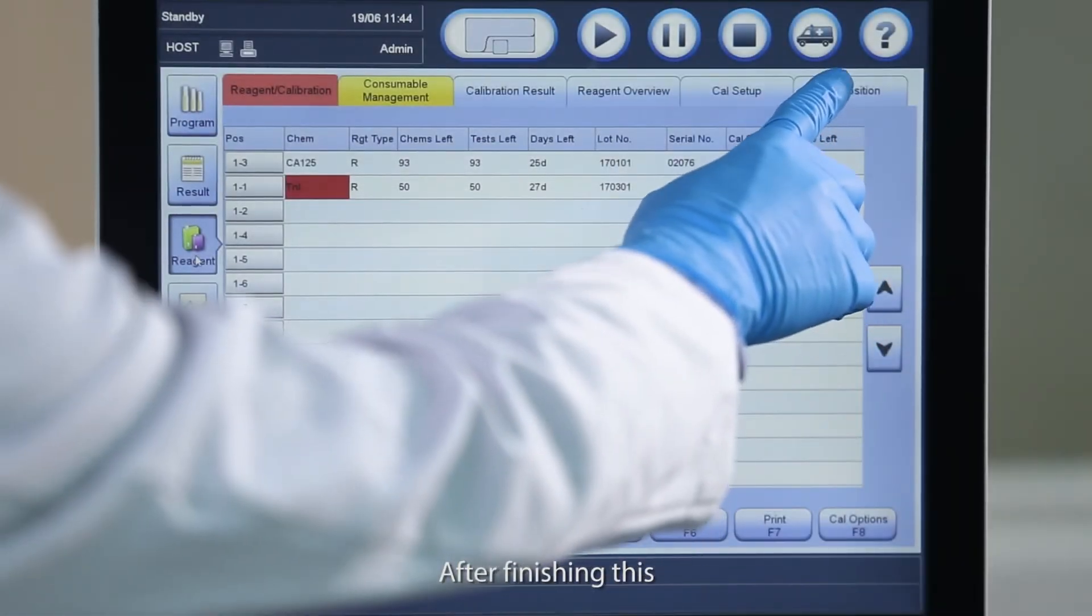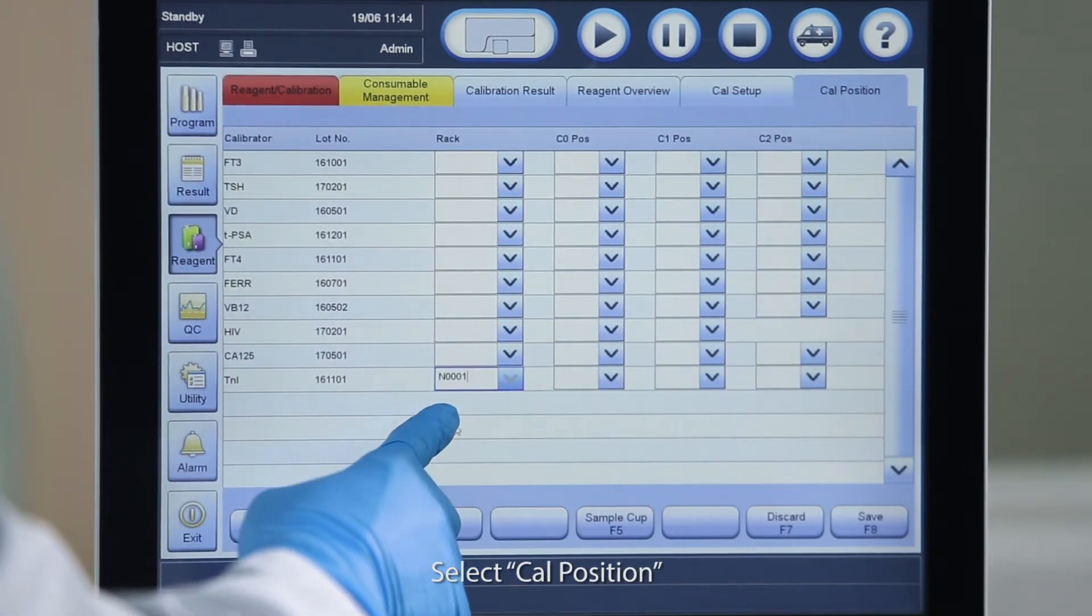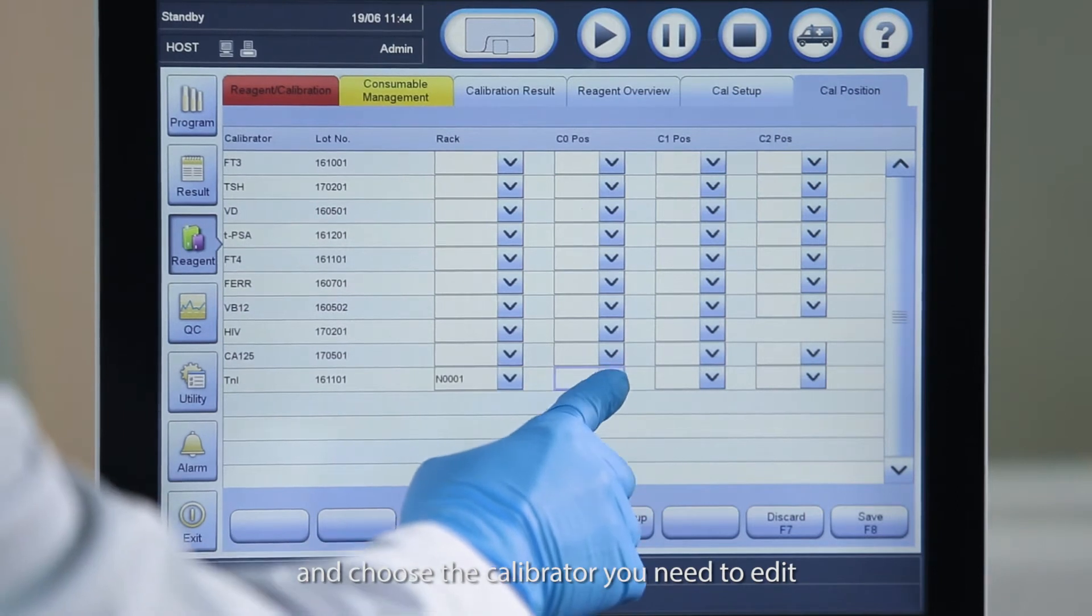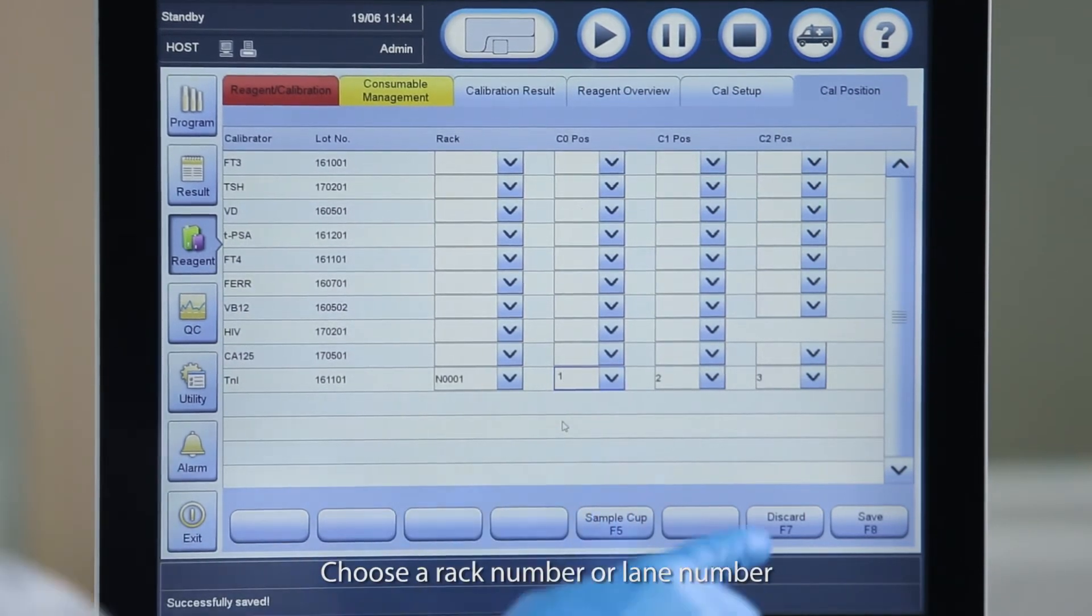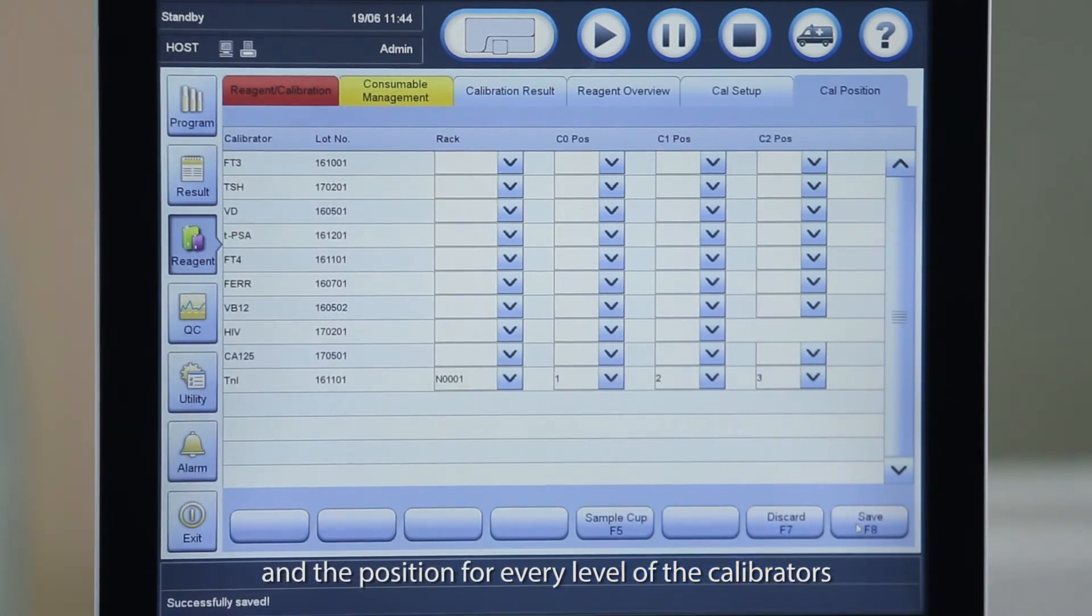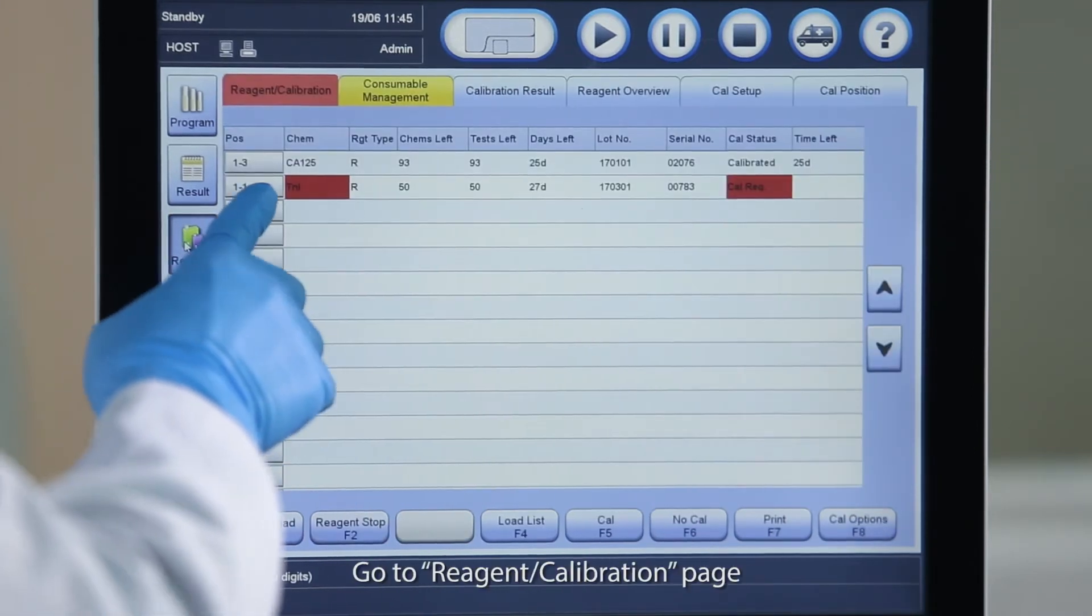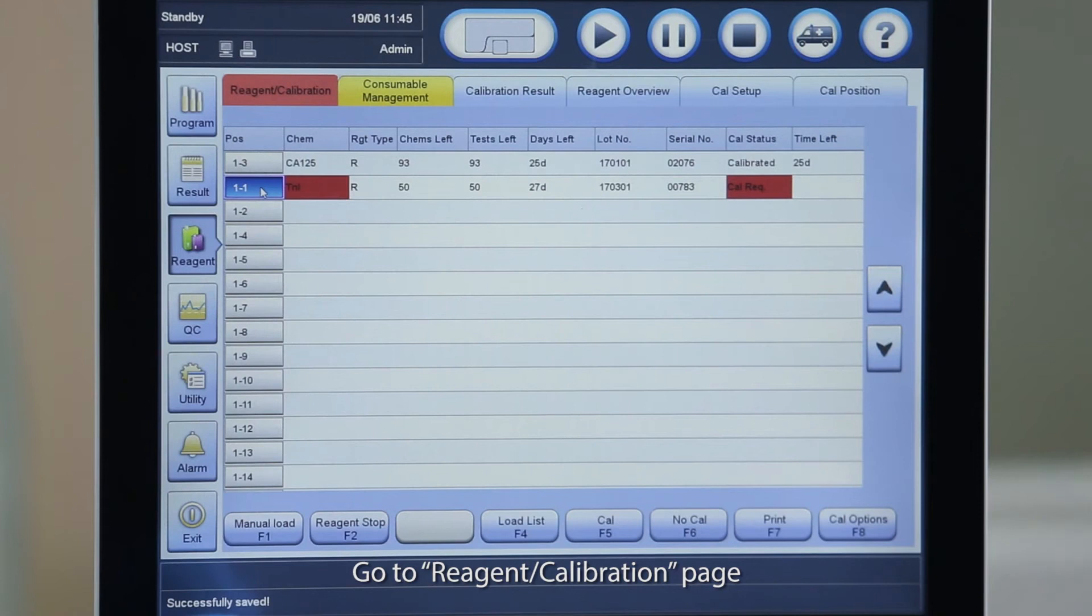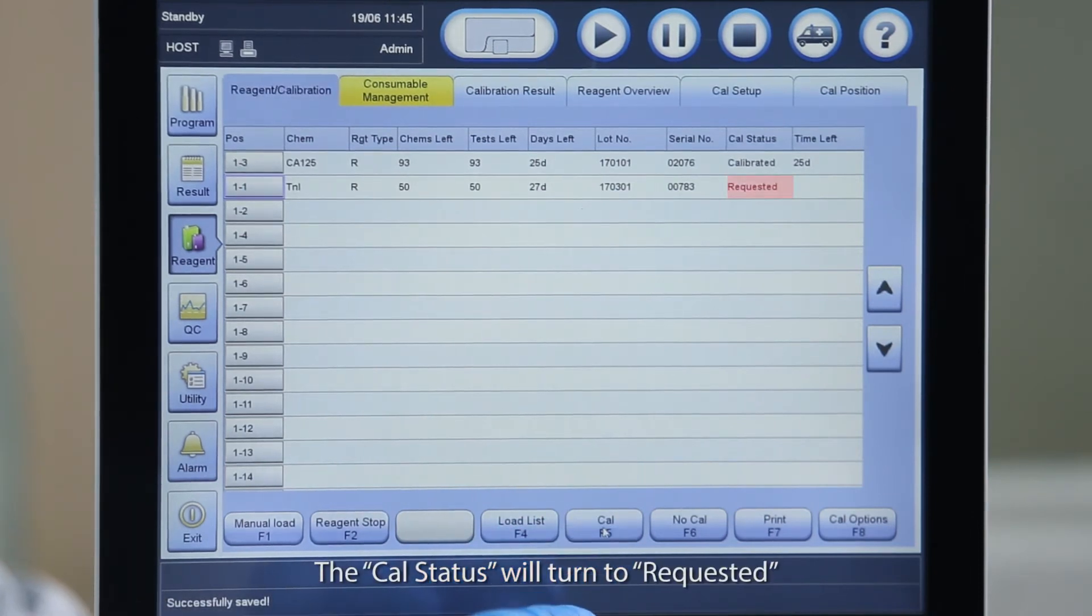After finishing this, we have to set up the calibrator position. Select Cal Position and choose the calibrator you need to edit. Choose a rack number or lane number and the position for every level of the calibrators. Next, we have to request calibration. Go to Reagent Calibration page. Select the chemistry that needs calibration. Select Cal. The Cal status will turn to Requested.